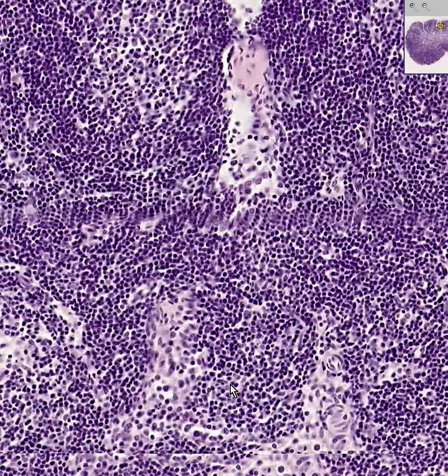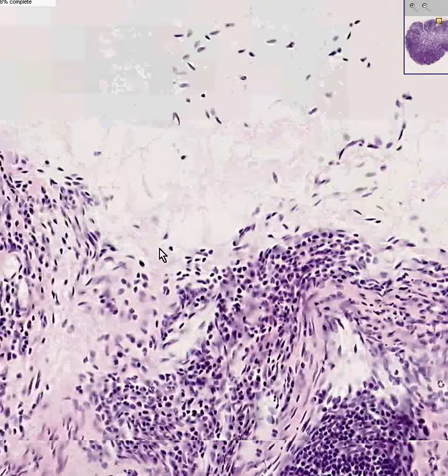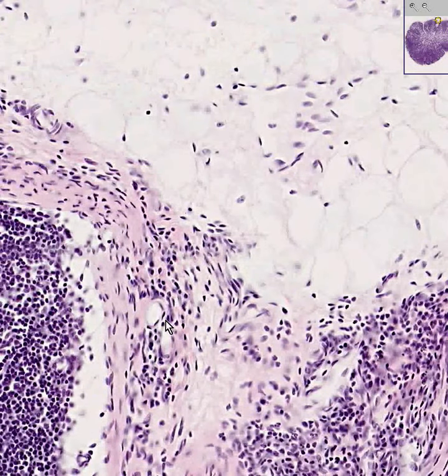If you look at the periphery of a lymph node and you see thin blood vessels that look like they don't have any blood inside of them, they may very well be lymphatic vessels, and 99% of the lymphatic vessels coming into a lymph node are afferent, or coming in. And there's only one or two, or perhaps only one, major efferent vessel coming out of that lymph node as part of a normal lymph drainage, and histologically they look the same as the afferent. So if you see a lymphatic vessel outside of a lymph node or near the capsule, most likely it's going to be an afferent. And you know what all this stuff is, don't you?